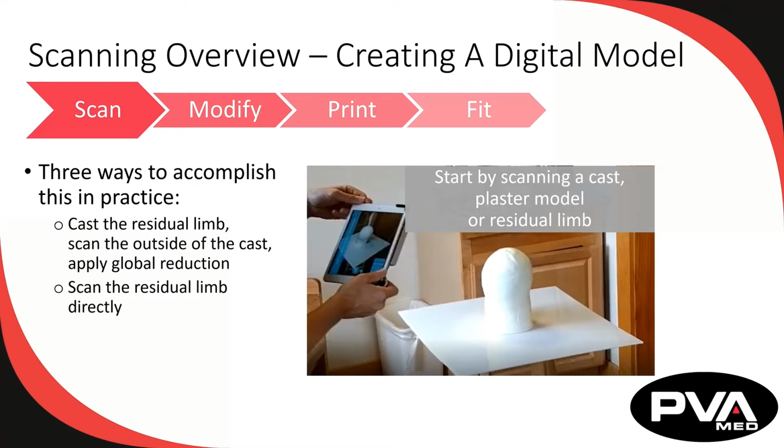The third common technique for creating a digital model of the patient's residual limb is to take measurements and then enter those into a software program that can then create an approximation of the residual limb. In practice, this is most applicable to above-knee patients, as these limbs tend to have more fleshy tissue and the socket design is more focused on containment rather than shape conformance. These tools are often referred to as AK by numbers.